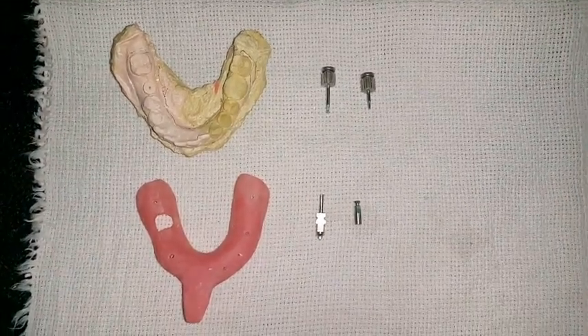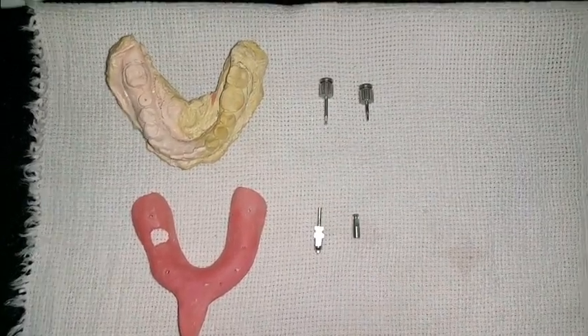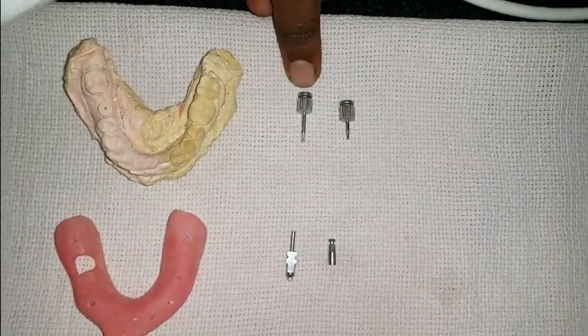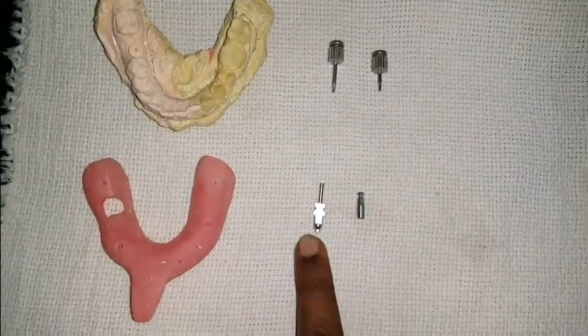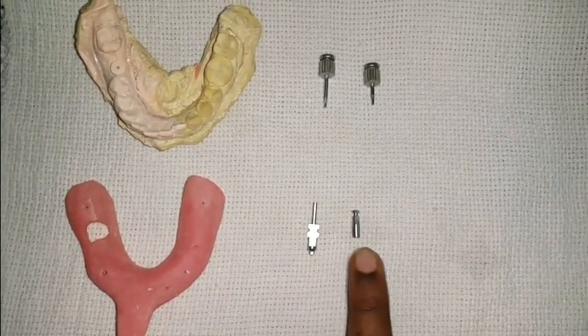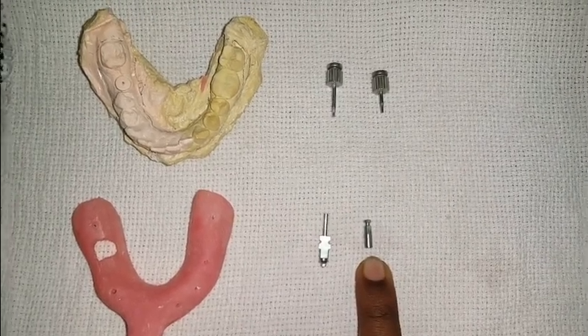For implant level impression using open tray you need few things like a custom tray where the window is already prepared, hex drivers to remove your gingival former, pickup type impression coping for open tray impression procedure, and a lab analog to replicate the implant fixture in the patient's mouth.